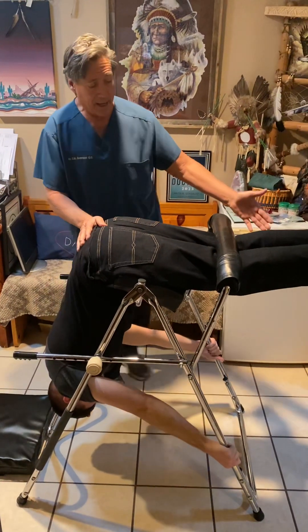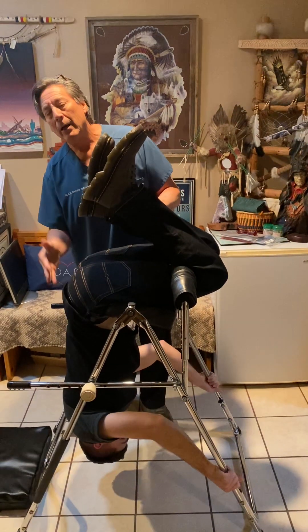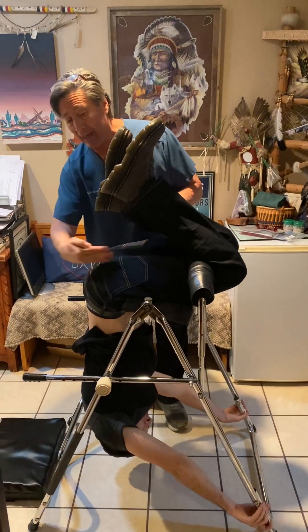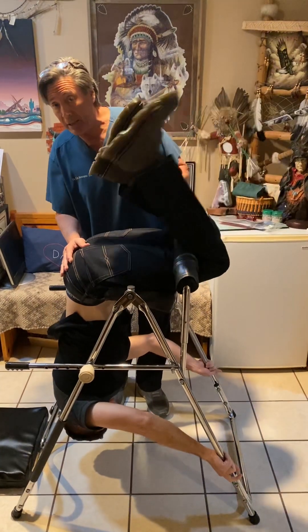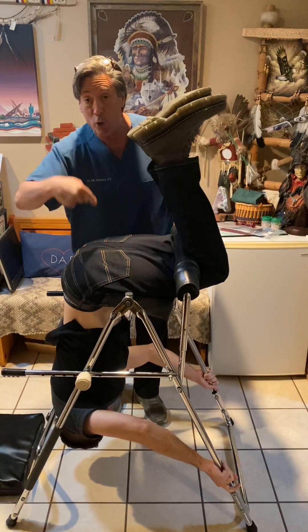You can also either keep your legs extended or bend them. I'll ask the patient, if they have sciatic pain or leg pain, does it feel better with your legs bent like this or does it feel better extended? Some people will say it feels better bent, some will say extended. Everybody's different — you've got to figure out what works for you.